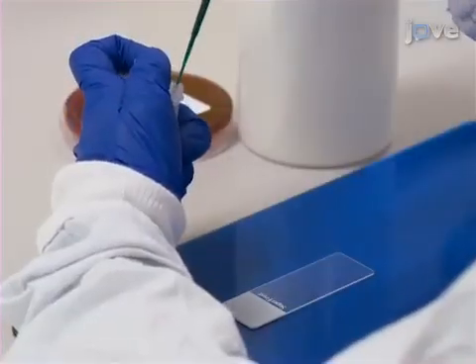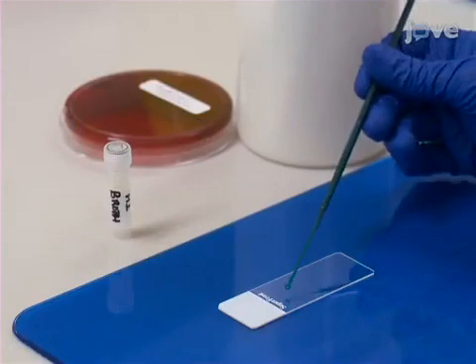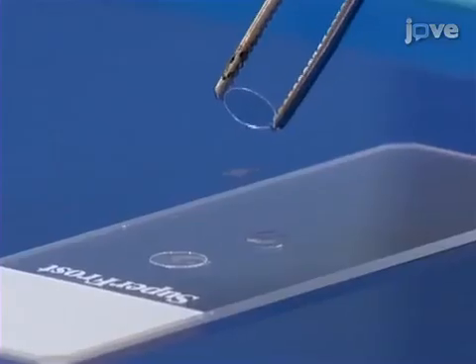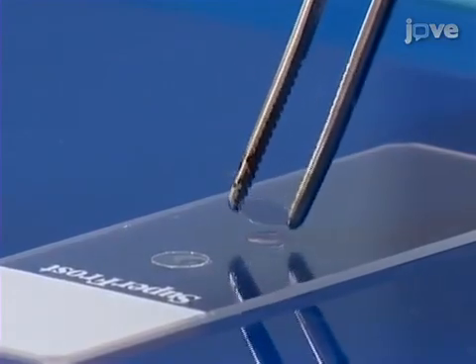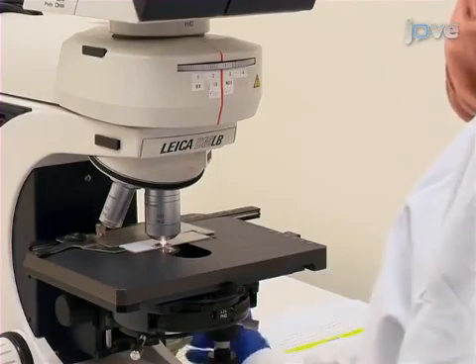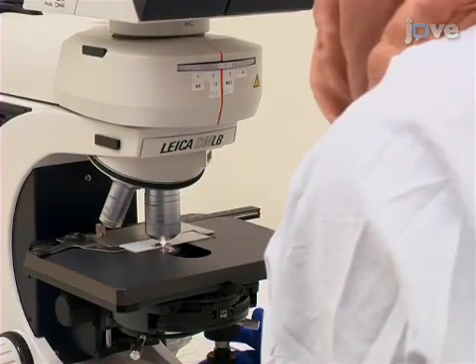Use a new 1 µL loop to transfer a drop of the inoculum onto a glass microscope slide. Next, place a small circular cover slip over the suspension and check the density of the suspension under phase contrast at 400x magnification. If the inoculum is too heavy, dilute the cell suspension with more broth and gently re-check.